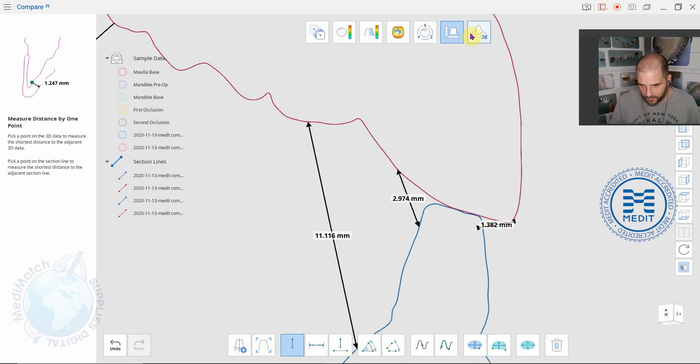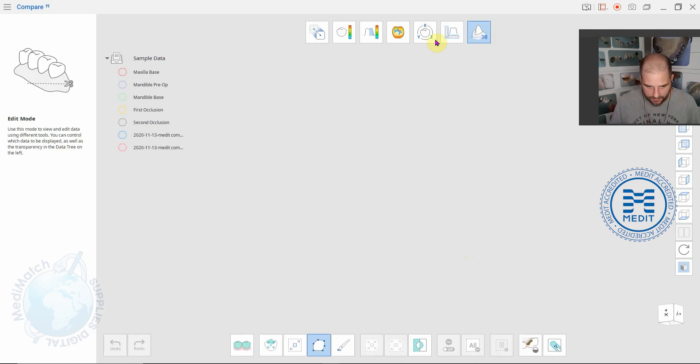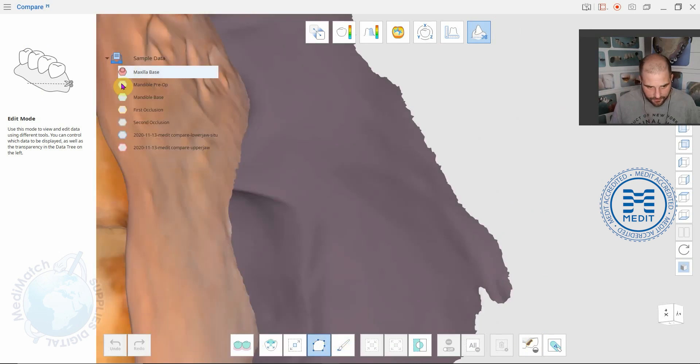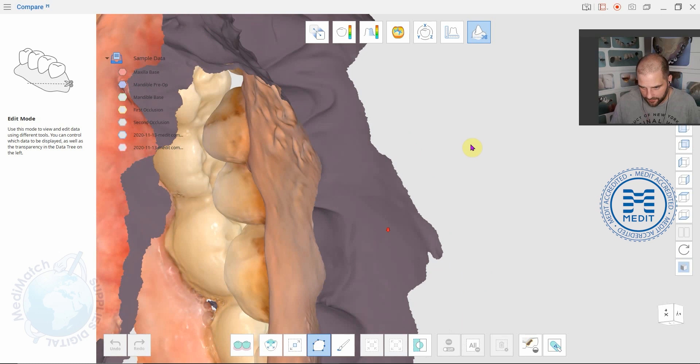Up at the top you've got some editing tools just like you have in Medit Link. You can just use the polyline trimming tool and the paint brush to select and delete data.